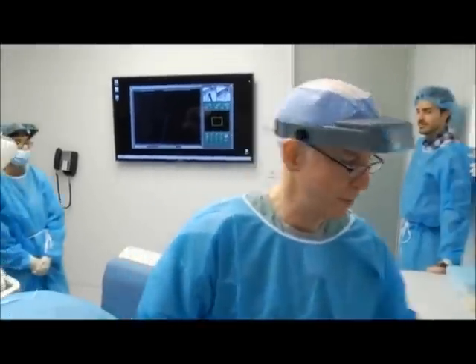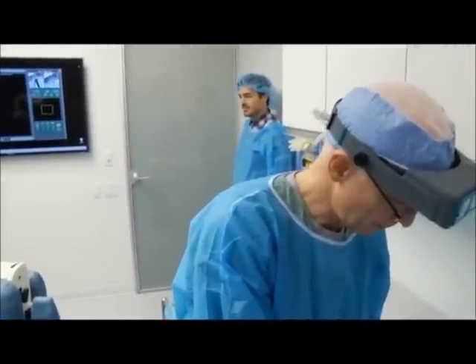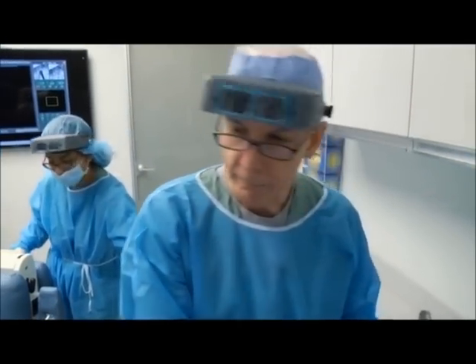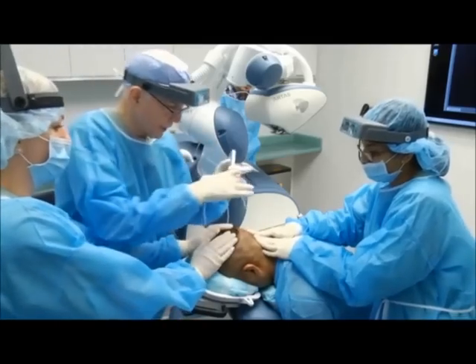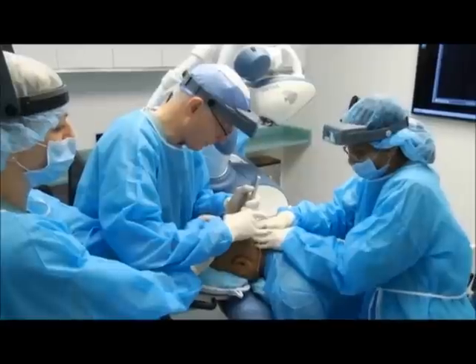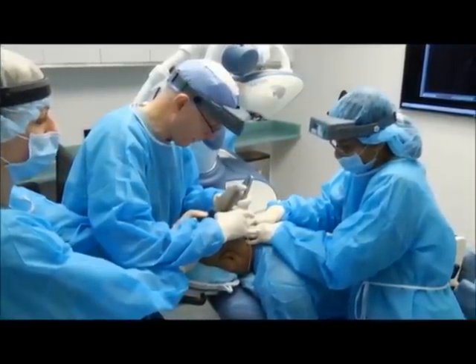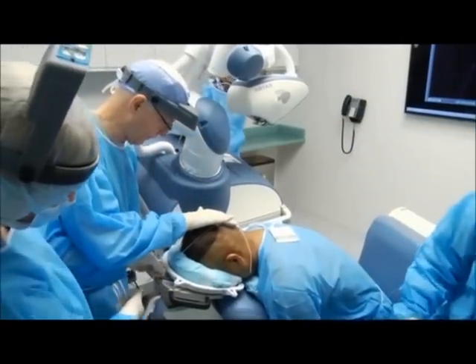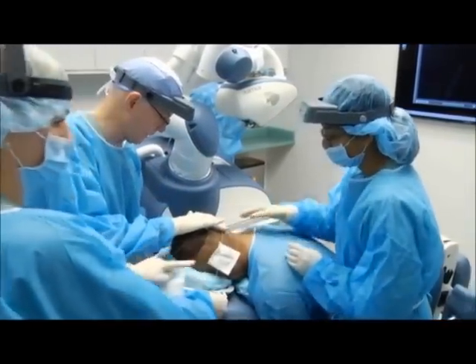Once the first grid is finished and the grafts are removed, we put the tensioner in a new position, placing it just below the old grid. We're now putting the tensioner on the second grid. We want to make sure that they're slightly overlapping so that you don't have a grid appearance after the harvest. We'll apply the elastic straps to keep it in place.